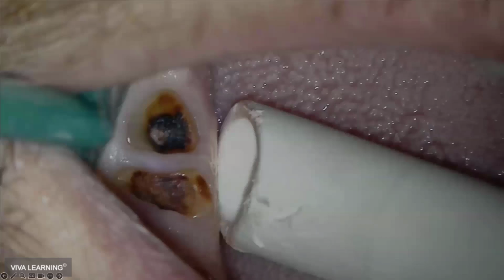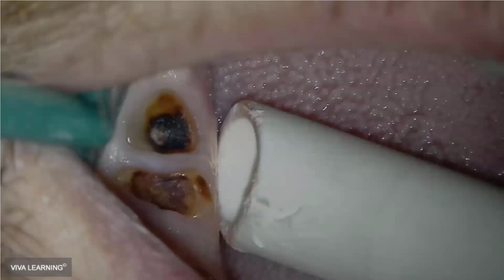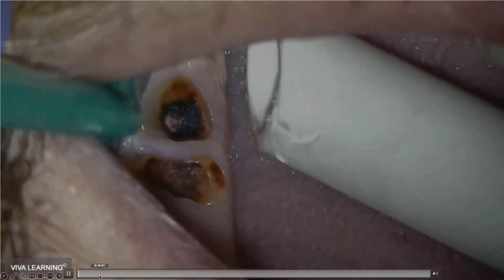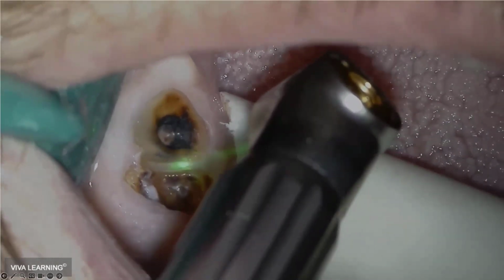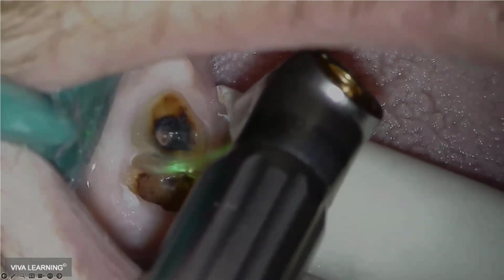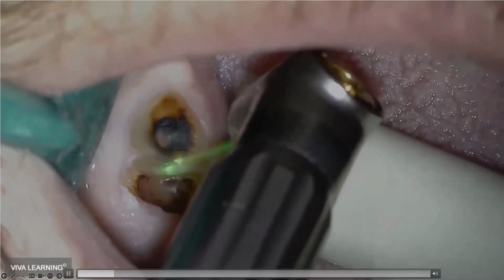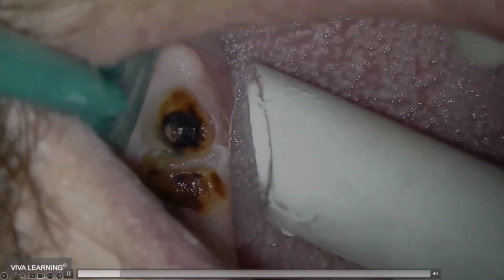Okay. I'm going to try to get in as many cases as I can and keep answering these questions. I'll let this play out, but this is the kind of case where you have a couple root tips in there and you go to grab them with the forceps and they just crumble, so you have to go in there and get that. Well, I can go in there with the laser and basically remove the bone around that tooth, hog in there, get that going. I'll just let this play out and answer some questions while we're going.